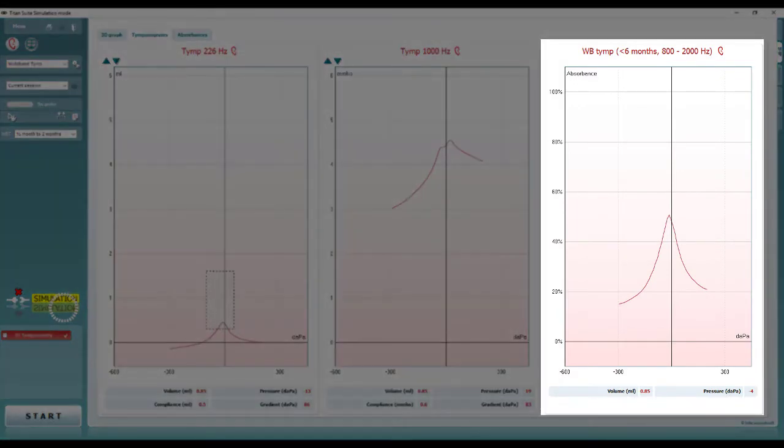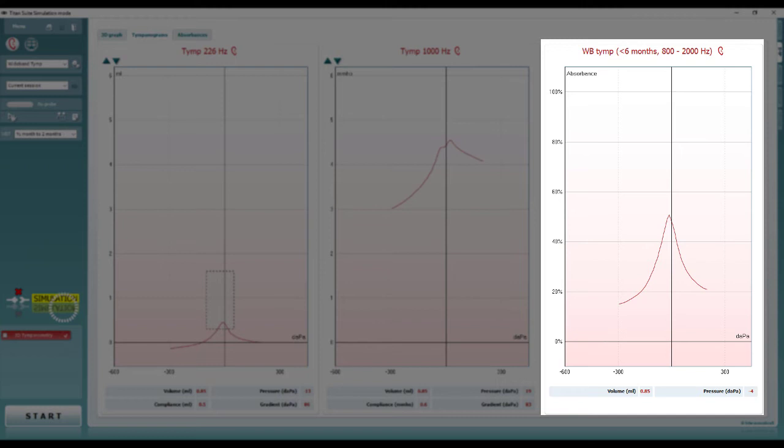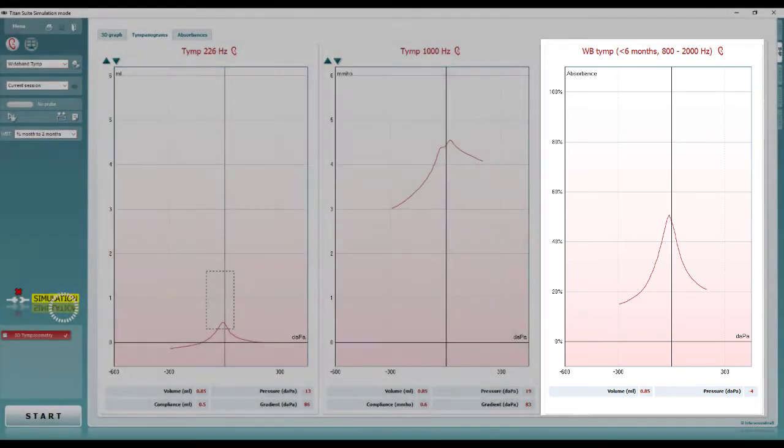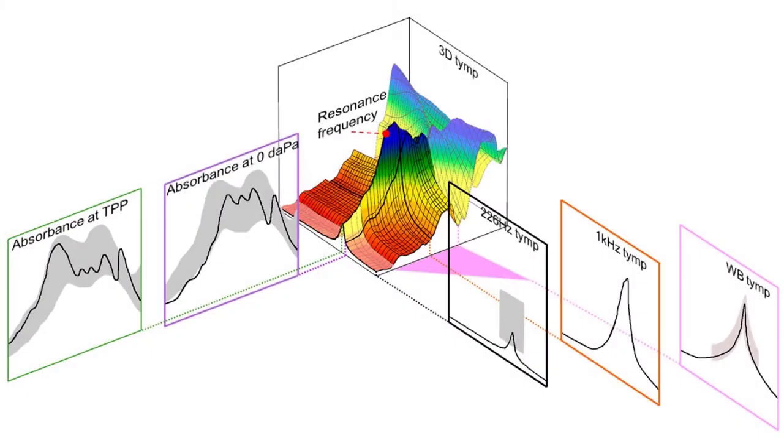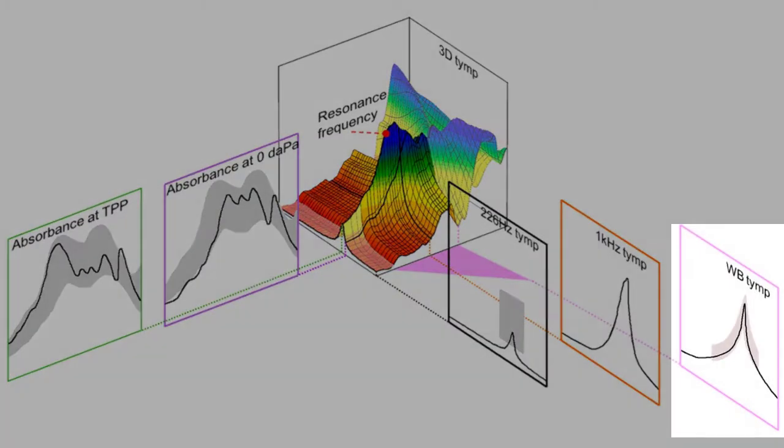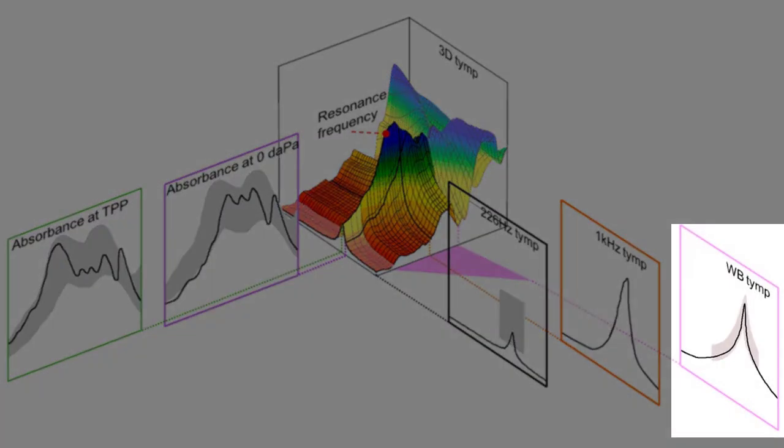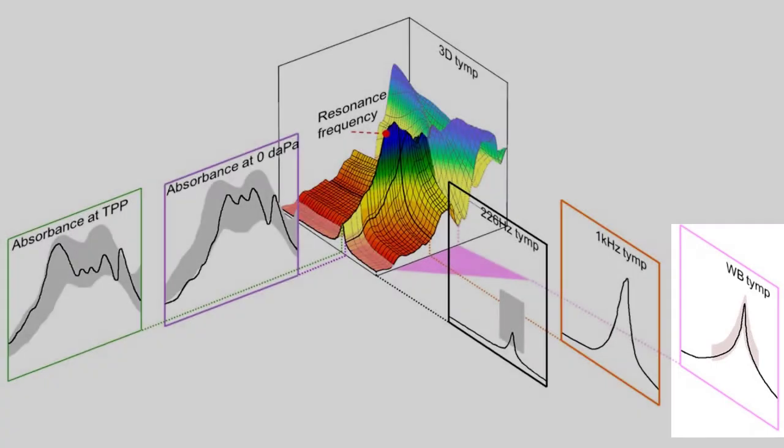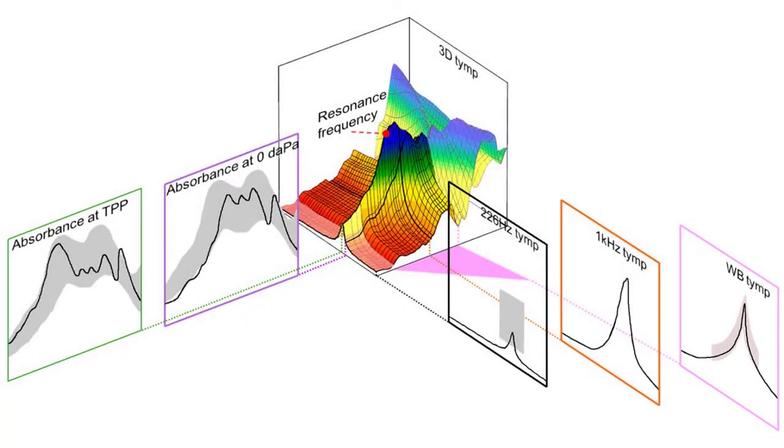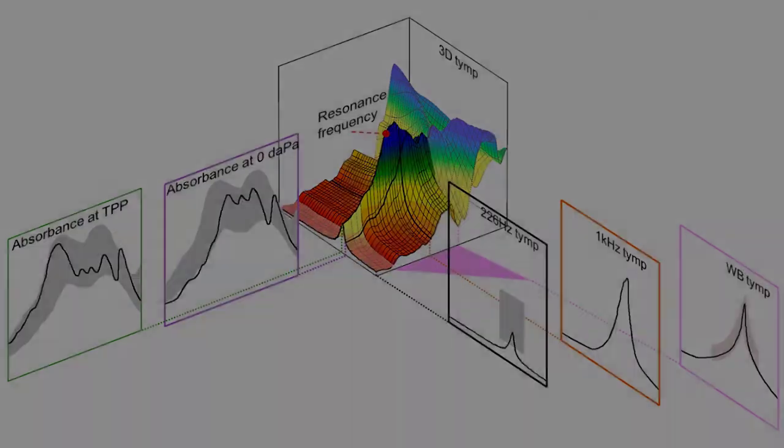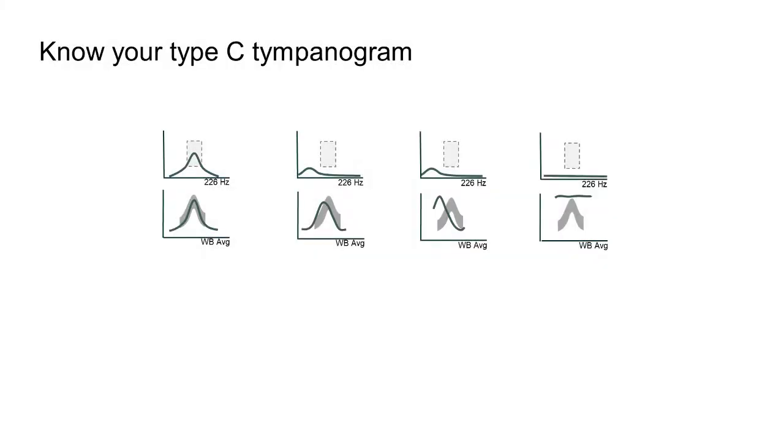The next layer of information provided by wideband tympanometry is the wideband average tympanogram. This measurement displays an average of all the single tone frequencies recorded, between 800 and 2000 Hz for children. The range for adults is 375 to 2000 Hz, and this is particularly useful for the pediatric population. The averaging process, just like in evoked potential testing, reduces the effect of unwanted noise from a test subject who may have been unsettled or upset during the test, and can provide clearer results than a single frequency tympanogram.